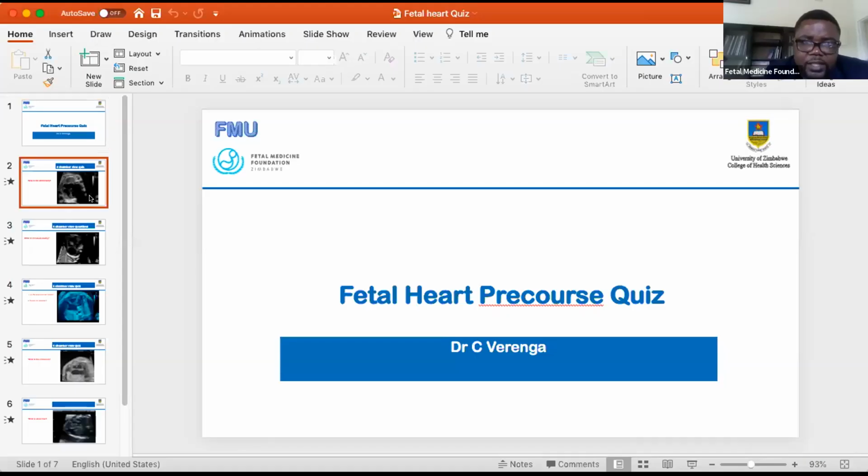Mr. Zanga is trying to restart the machine, so I'll be going through some questions. Please clarify on the angle between the foot and the tib and the fib. Simba, you should answer these questions. If you are available, please answer the question. There is a question in the chat box. People want to know, how do you distinguish? How can you say there is club foot, there is no club foot? Just a few questions while Mr. Zanga is sorting out his machine.